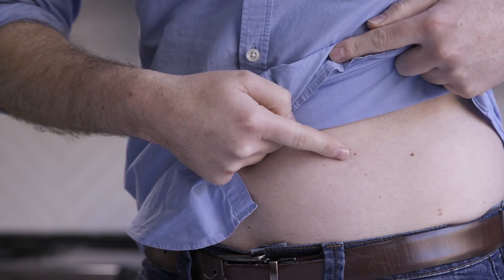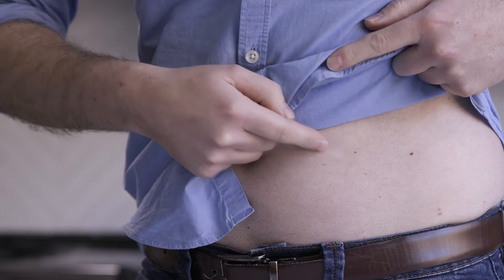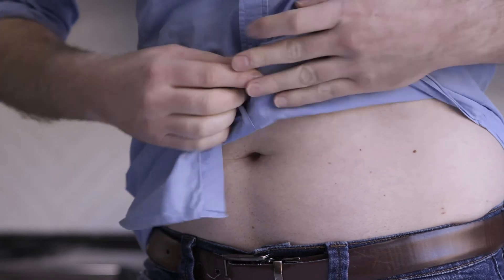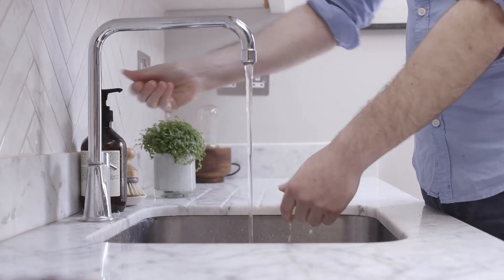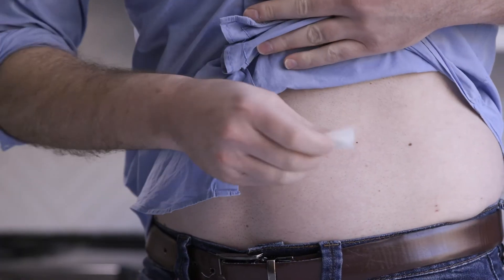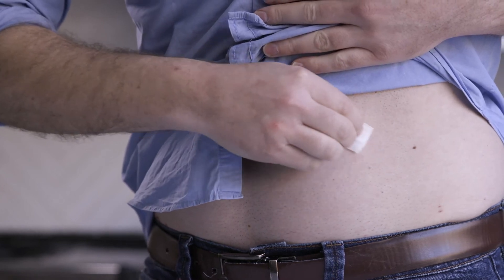Avoid sites with irritated skin, bones, tattoos, or areas that get bumped. Before you begin, wash your hands. Then clean your skin with rubbing alcohol and let it dry.